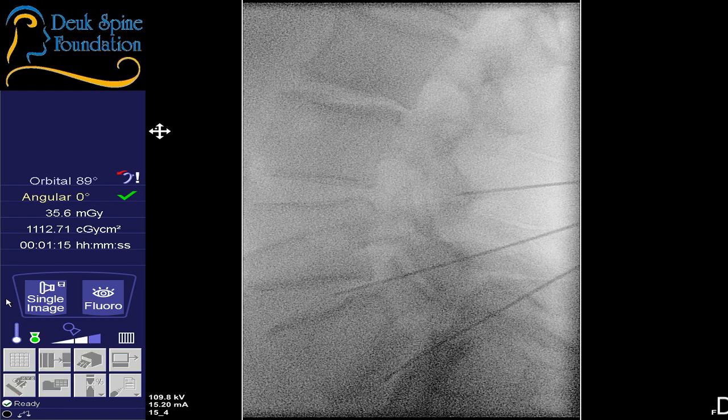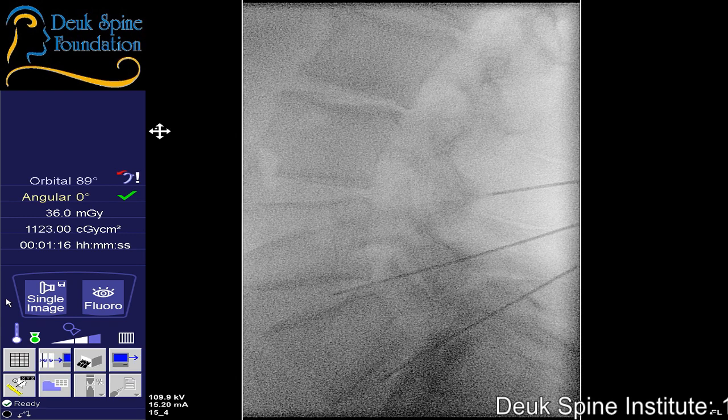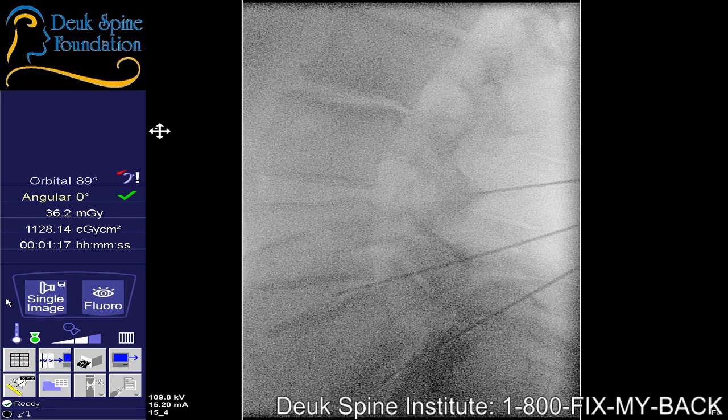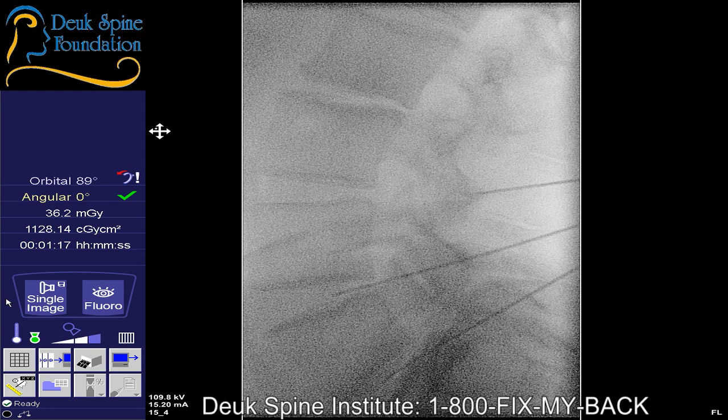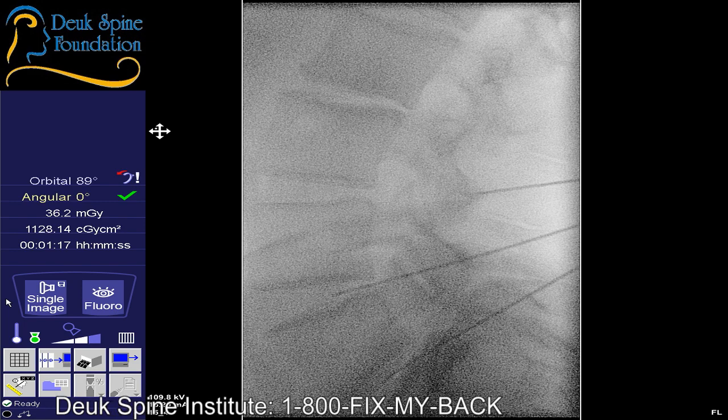And what you're seeing are x-ray pictures. We use the x-ray because the target is not a bony target, but it's a joint between two bones, and really the only way to see it and visualize it is going to be using an x-ray machine.